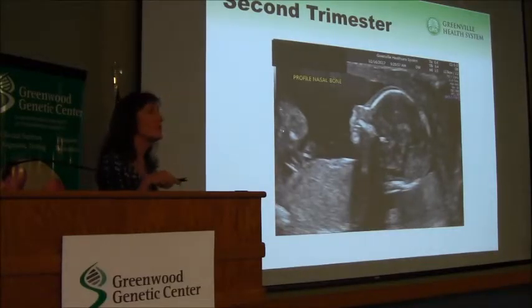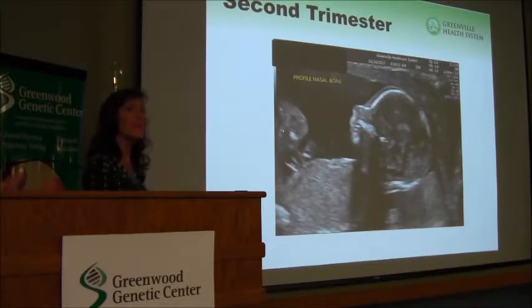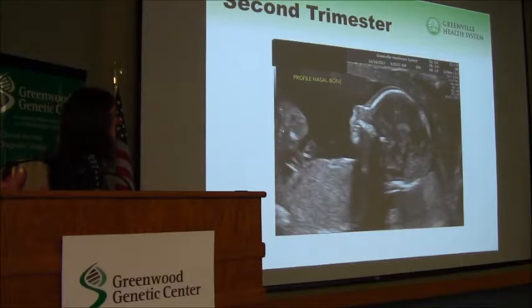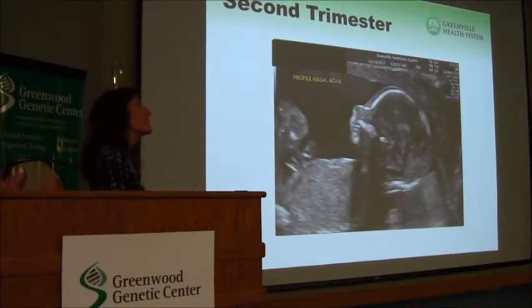All right, this is the interactive part. I'm going to put some pictures up and let you just yell out, what do you see? So for the dysmorphologist in the room, they ought to get this profile view and what I'm getting at that's unusual here. This is the forehead, this is the nose. Micrognathia, great. So, very important when we're looking at babies that might have trisomy 18, Treacher-Collins. I'm sure Dr. Hall could list a whole list of things that might be associated with micrognathia.